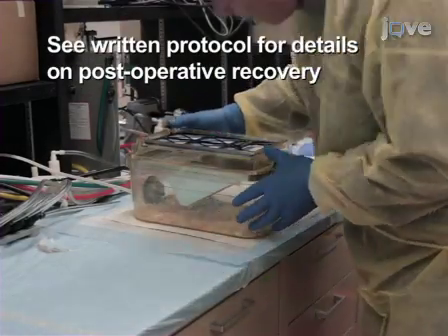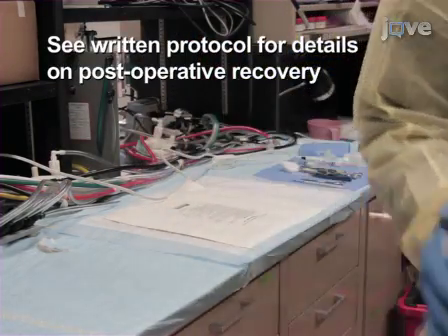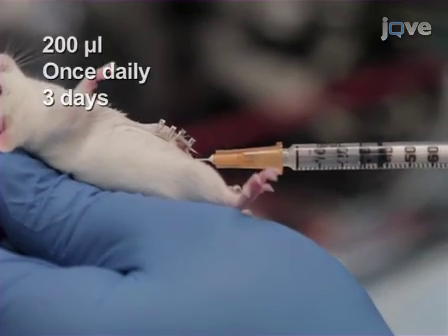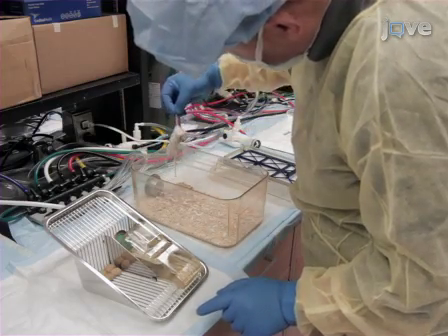After animals regain consciousness and mobility, return the cage back to the animal room. At 24 hours post-CLP, intraperitoneally administer 200 microliters of herbal extract or control daily for 3 days. Monitor the animal for survival as long as needed.